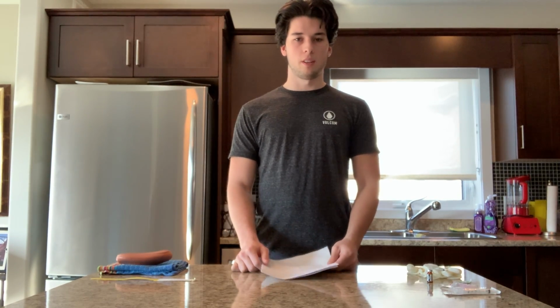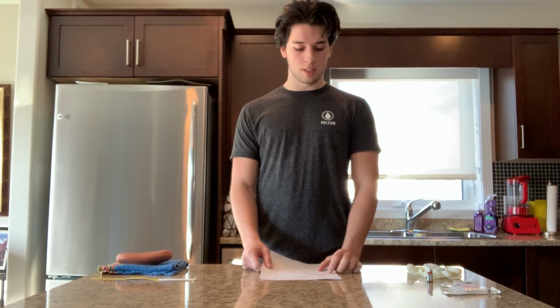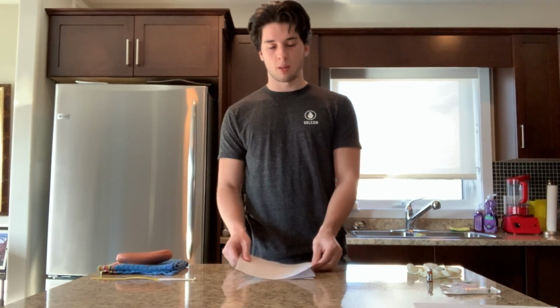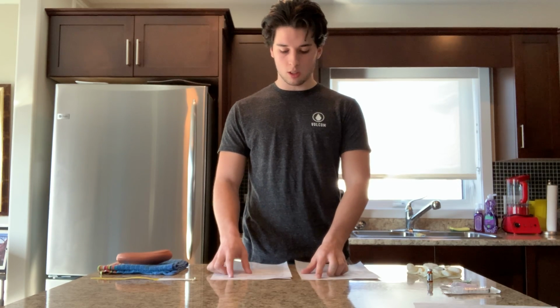Hello, my name is Pharand, and today I will be demonstrating a subcutaneous injection. So to start, we're going to look at our scenario that today is February 7th, 2021, and the time is 08:25 in the morning. So to start off, we're going to start with our first check by comparing our physician's orders to our MAR. So we're going to look at the patient's name first, Jake, nursing.